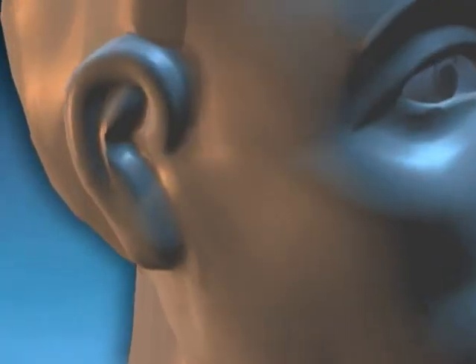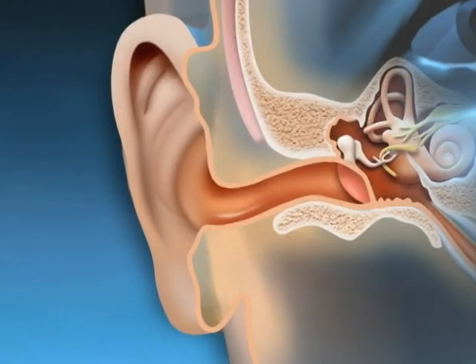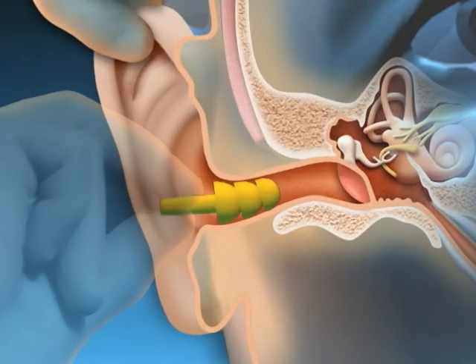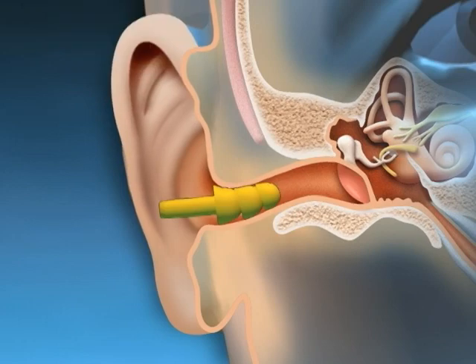The reason that we do this, as shown here, is that pulling on the ear changes the shape of the ear canal opening. It straightens and enlarges the ear canal to make it easier to push the plug into place. By the way, I want you to reach over your head to pull on your ear with the hand opposite the ear that is being fitted so that you can be bringing the earplug to the ear with the same hand as the ear you are fitting. This gives you better control of the earplug for a better insertion. So for example, use your right hand to insert the earplug into your right ear.